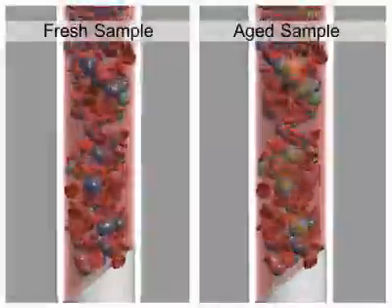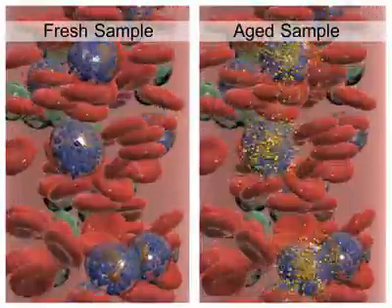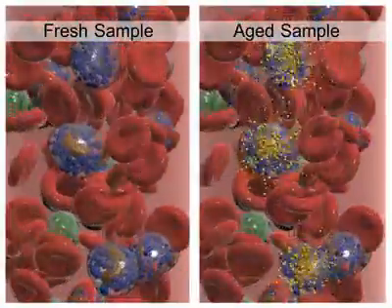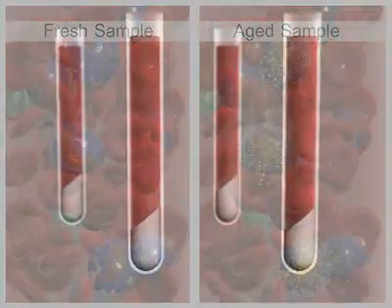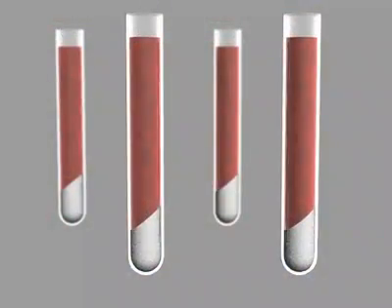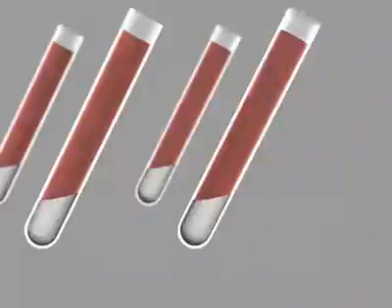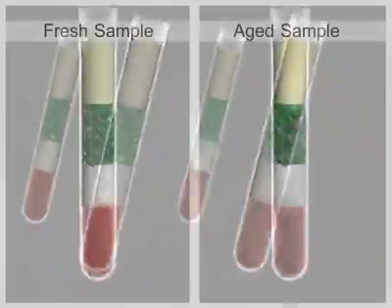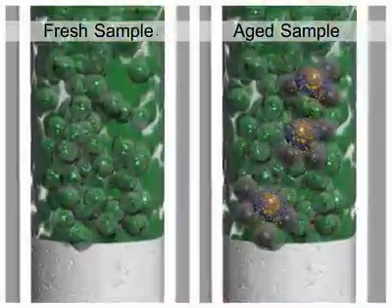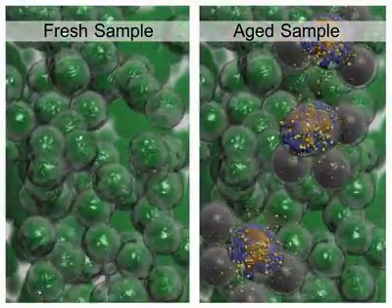When blood samples are stored for more than 8 hours, there may be degranulation of granulocytes. As a result, there is a reduction in density, and the lighter granulocytes can contaminate the PBMC layer after density gradient centrifugation.